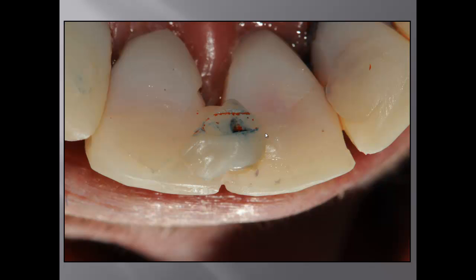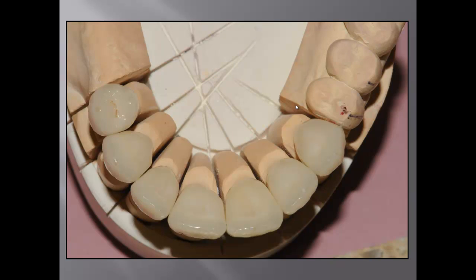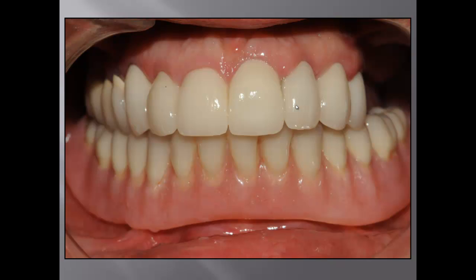So I sent the patient home, and the patient came back to me. We received the crowns from my technician, and I can establish a nice bite and nice aesthetics. I check the bite in the patient's mouth, cement the crowns, and make sure we establish a nice bite. The patient at that moment says we established the bite. She does a jaw movement, and she finds the bite right away.